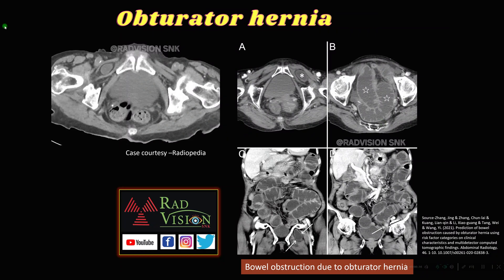Next, here you can see herniation of the small bowel loop between the obturator internus and pectineus muscle — this is called obturator hernia. Here also there is obturator hernia but with obstruction — this is bowel obstruction due to left-sided obturator hernia.